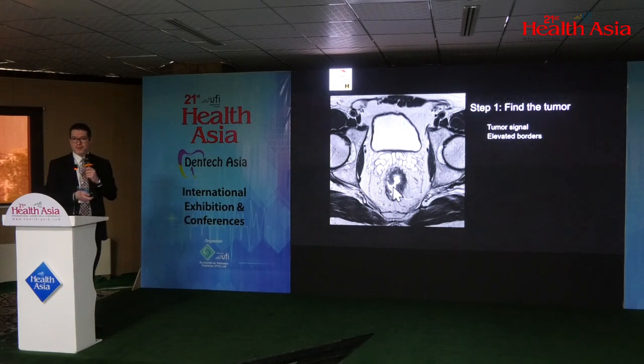A lot of times you're just able to see the tumor right exactly where it is, but I can't emphasize enough on trying to utilize clinical notes that have been provided to you. Like I said initially, a lot of these patients are going to come up after they have already been given a diagnosis of rectal CA, and then they're going to come to you for an MR for staging. So if you already know where the tumor is based on the colonoscopy report, based on the surgeon's assessment, you can utilize that to add onto your imaging findings.